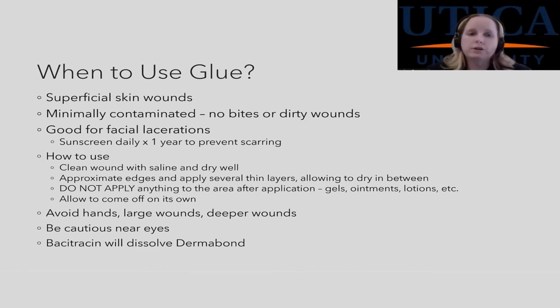Glue is really good for facial lacerations. If you've got a cut up here, you can hold it together and glue it, and it will stay very well. Everybody says, am I going to have a scar? Once it is done healing and the glue comes off, you want to tell them to use sunscreen on the area daily for a year to prevent scarring. Rain, snow, sunshine, doesn't matter what the weather is.